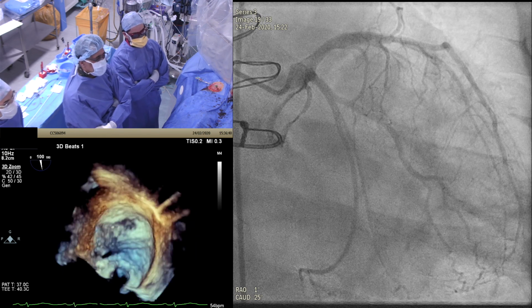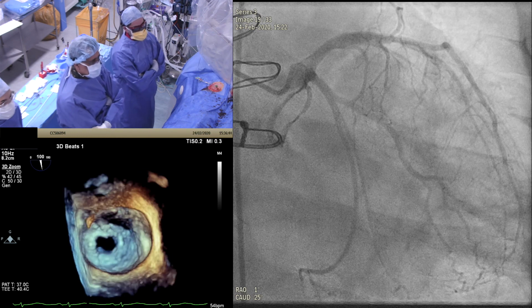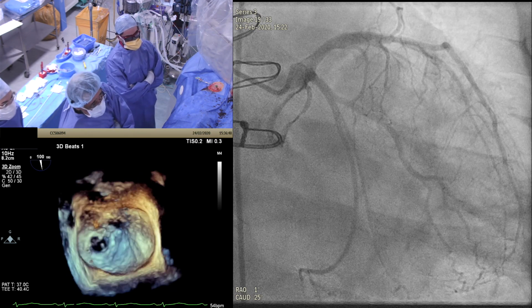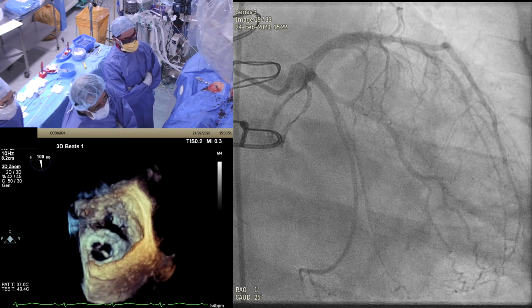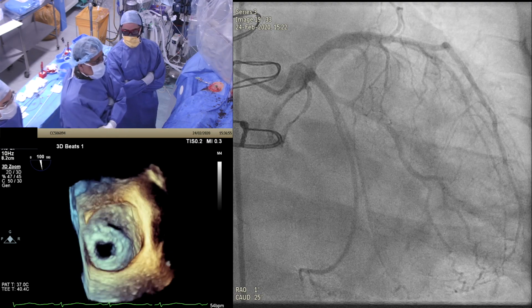But I think, as you say, it will depend a little bit on how it all behaves and what you can deliver through that with all the angles. I think the hemolysis concern is an absolutely real one, especially with personal experience. But I think the aim here should be to try and exclude as much of the area as possible, hopefully with one device at the first go.